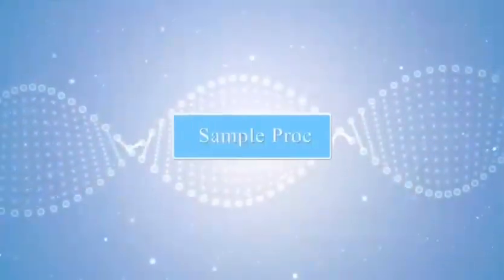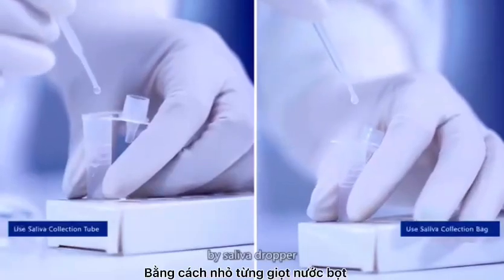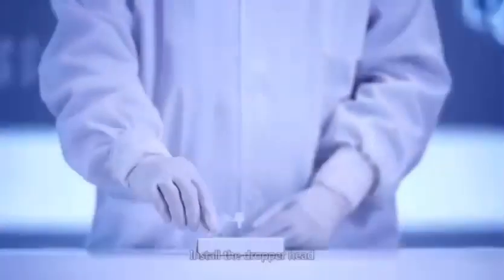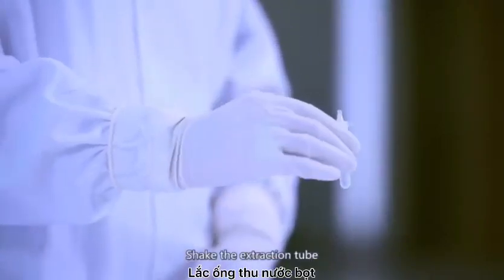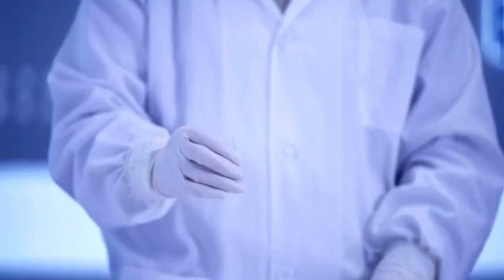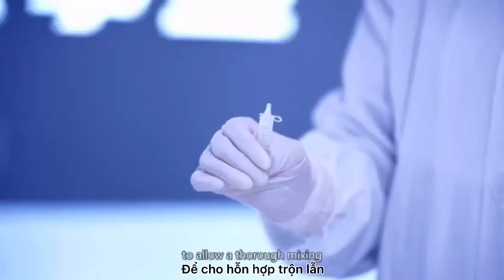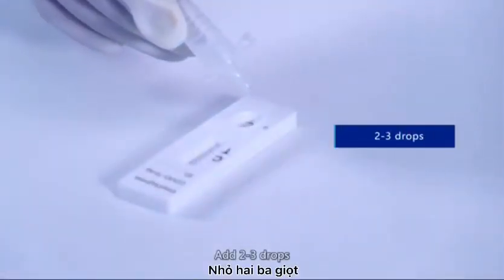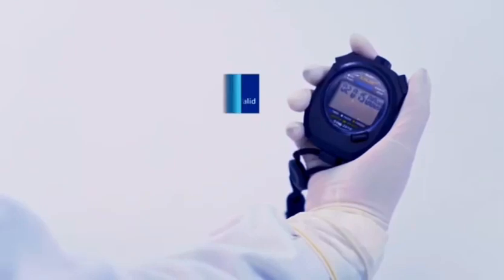Sample processing. Add 2 drops of saliva into the extraction tube using the saliva dropper. Install the dropper head on the extraction tube. Shake the extraction tube vigorously to mix the saliva and the extraction buffer. Squeeze the tube at least 10 times to allow thorough mixing. Add 2 to 3 drops into the specimen well of the test cassette and start the timer.